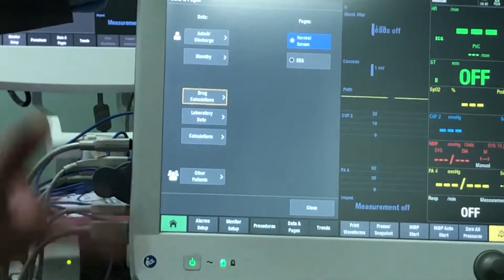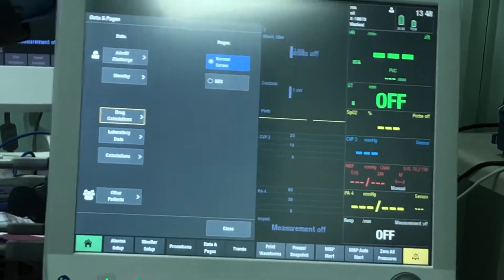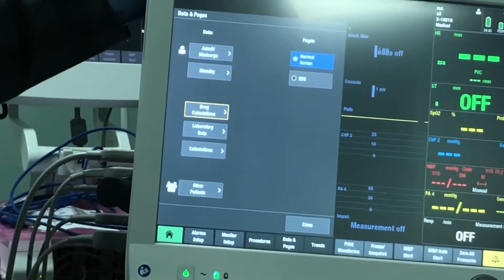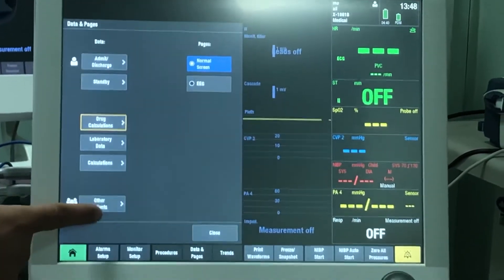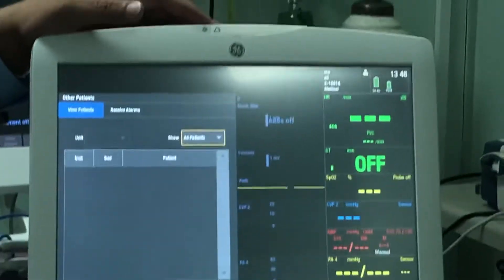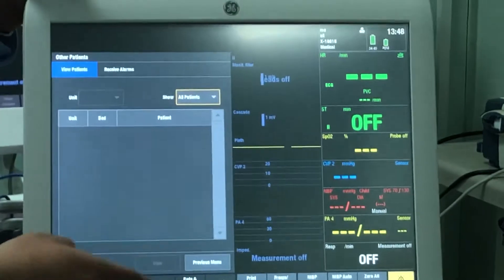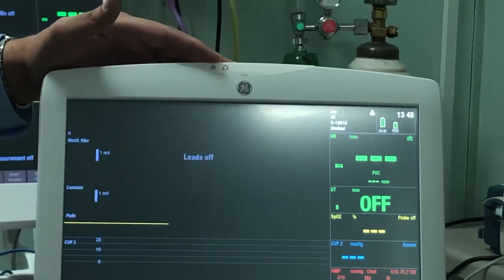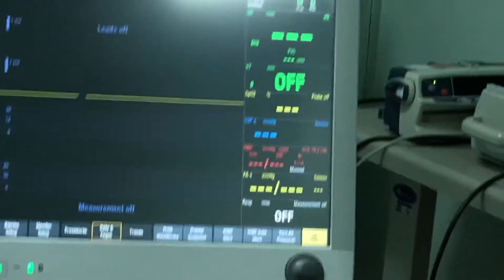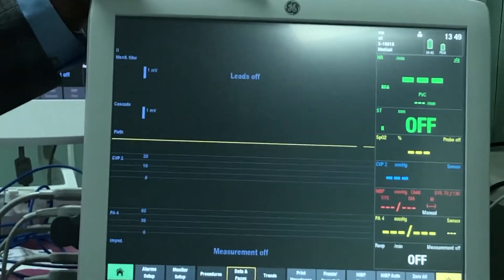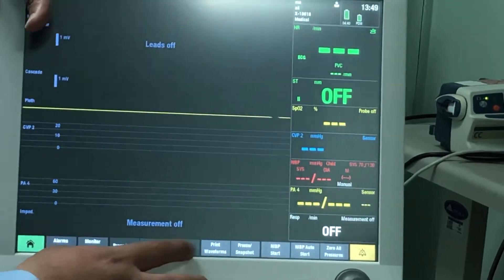Another nice feature in data and pages is 'other patients.' All monitors are connected to each other — even without a central station, the monitors can communicate through Wi-Fi. So if you're handling more than one patient, you can have two patients' screens on one screen. IT will connect all monitors in the department, so you'll see all beds — for example, 10 beds in ER — and their patients. Choosing one gives a live split-screen view, where you can see alarms and silence low and medium alarms remotely, but for high alarms you must physically go to the patient.